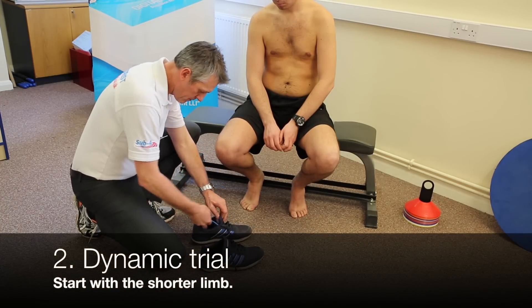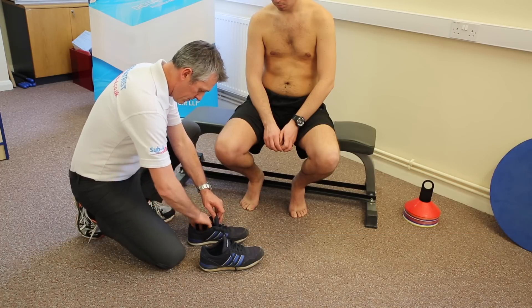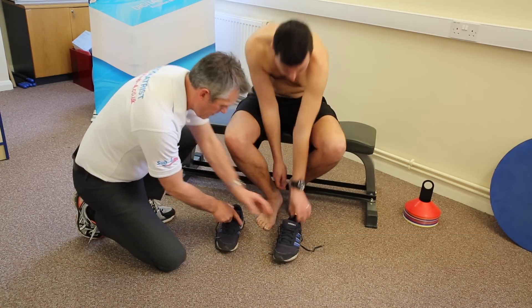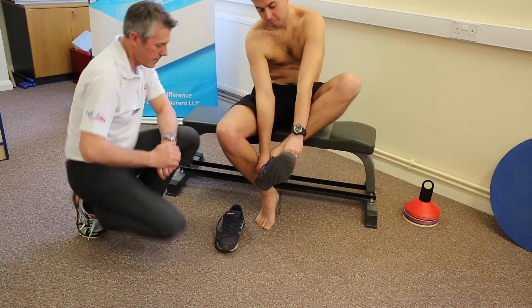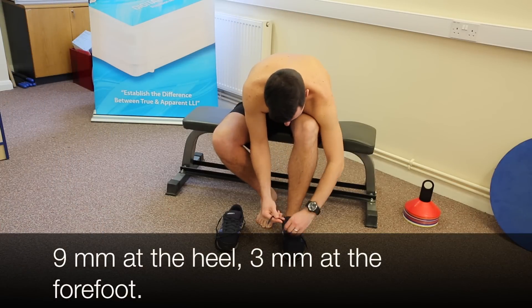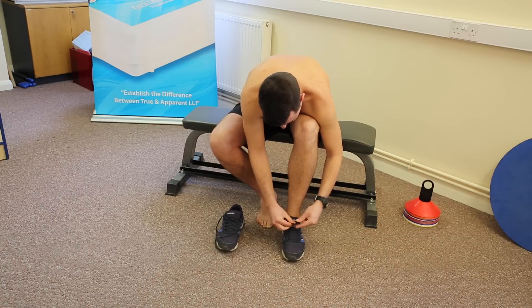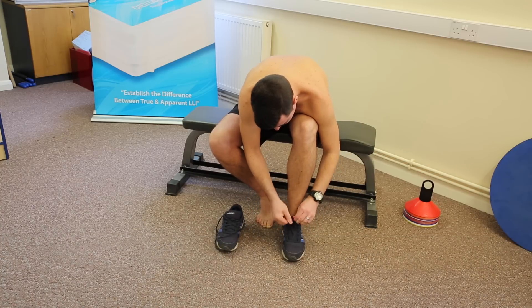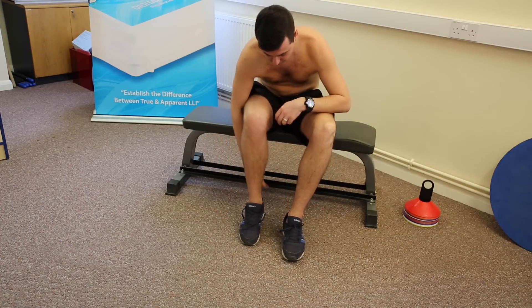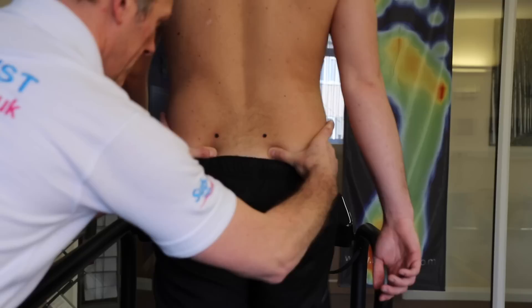This is the dynamic functional trial. We place the blue raises — 9mm at the rear foot and 3mm at the forefoot, giving us a 6mm drop off — and place both shoes back on. We don't put 9mm the whole length of the shoe because it won't fit inside; 9mm at the heel is good enough to get the same kind of response.